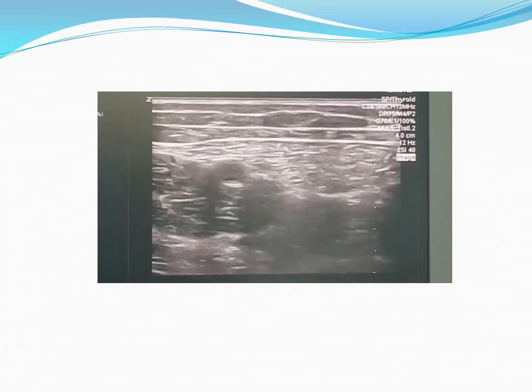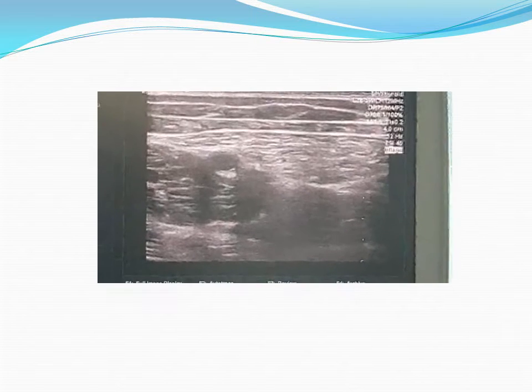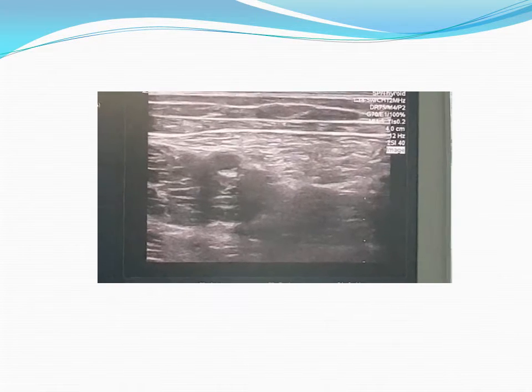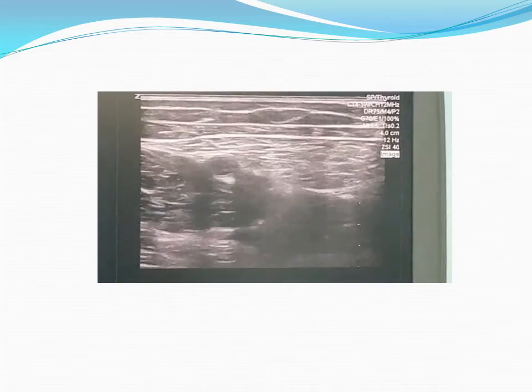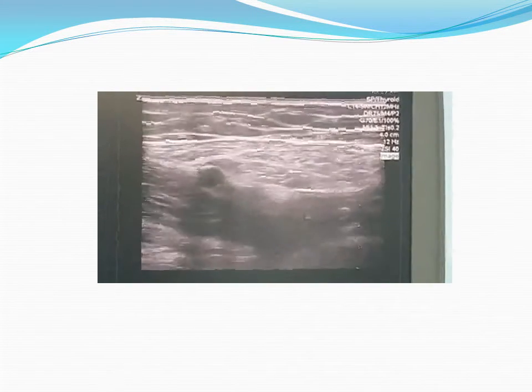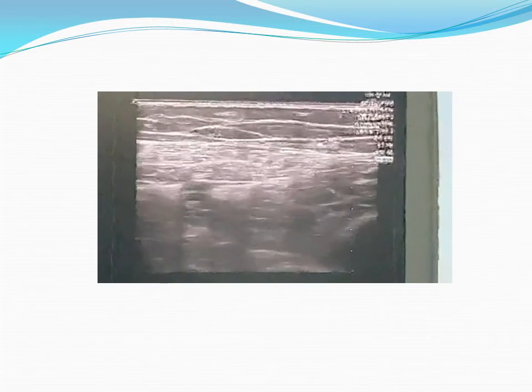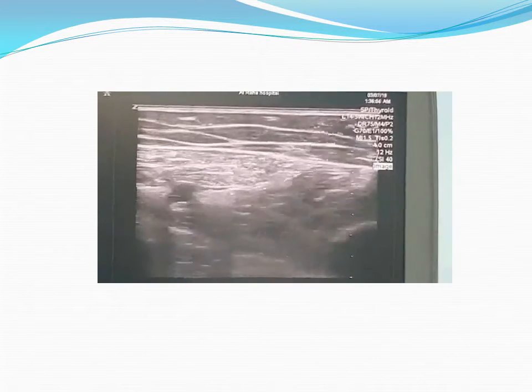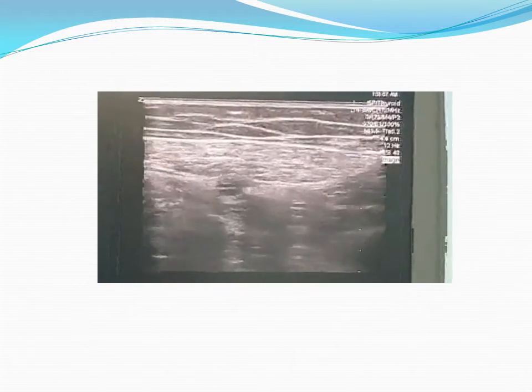Now this is the superficial femoral artery. The adductor canal block is on the medial side of the sartorius muscle, under the sartorius cover. This is proximal in the adductor canal block, maybe in the femoral triangle. We are going more laterally. The artery is going more laterally, and here this is lateral and the other side is medial. So now in this position it is more lateral.